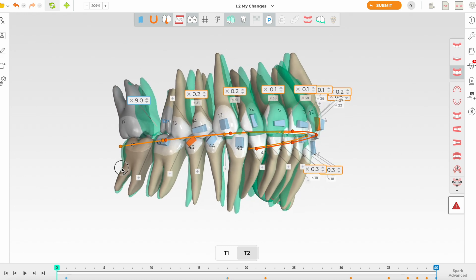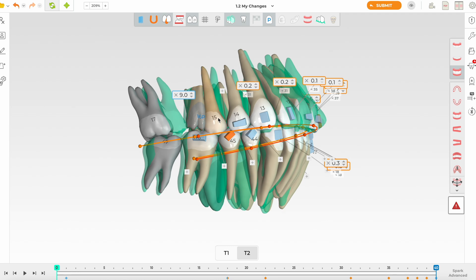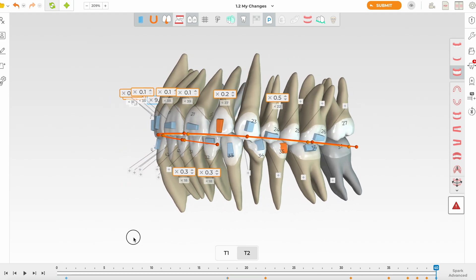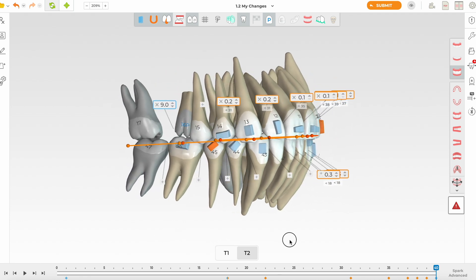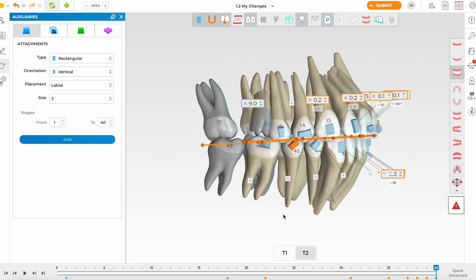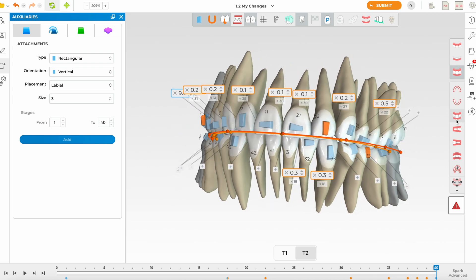We'll lock these positions and the space. Now removing the superimposition — we've got the transverse set correctly. The sagittal is straightforward since she was always class one to begin with and we've recreated that. I'm going to add an attachment here because of the amount of push needed, and I'll use twin attachments — double attachments, one on the distal buccal cusp and one on the mesial buccal cusp. I'll also untip the tooth slightly, as these are estimations to be refined later.